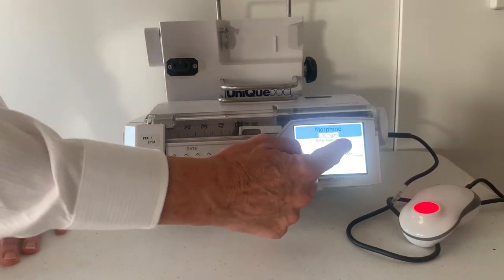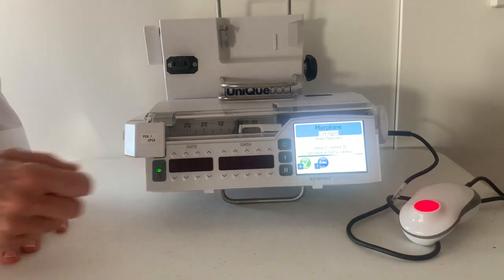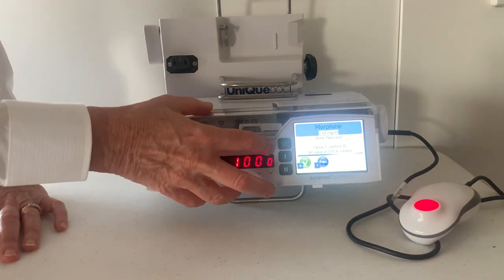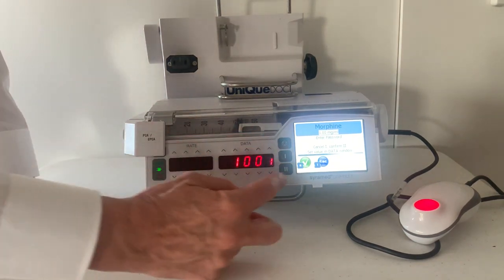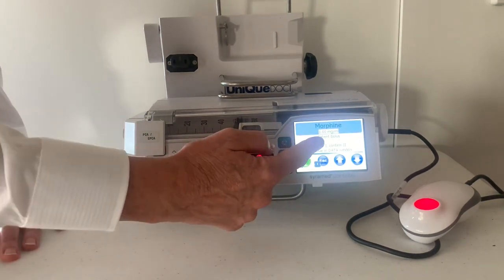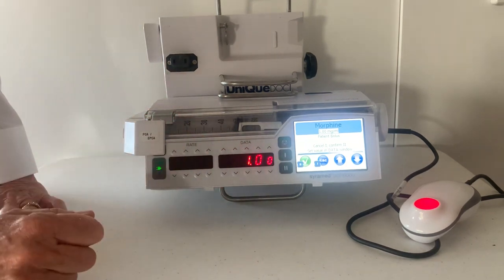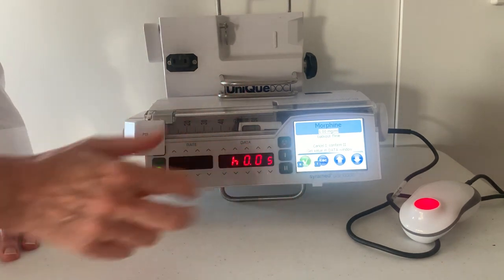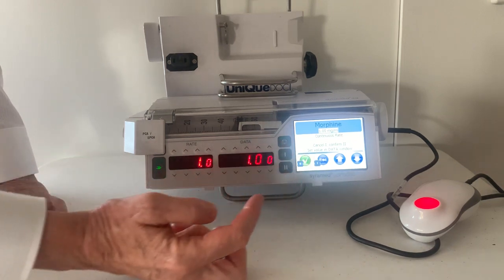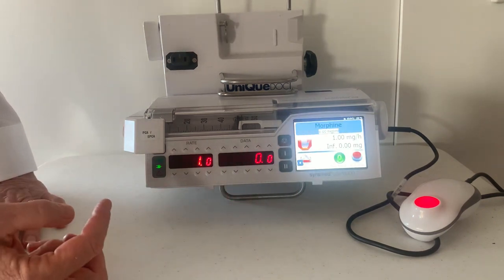The pump is now asking me for a passcode and it's flashing red here to tell me this is where I have to enter it. Each hospital has their own passcode, so I'm going to enter 1001 and tick to confirm. It's now asking me for the patient bolus — you can use the up and down arrows, but I'm going to keep it at one milligram and tick to confirm. The lockout I'm going to keep — tick to confirm — and the continuous rate — tick to confirm.